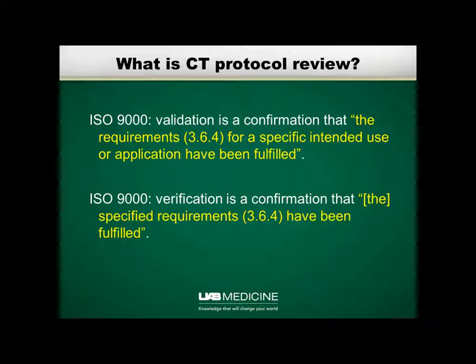Well, in CT protocols, this means, does this protocol give the radiologist the image that they want? Are we using no more than the amount of radiation that's necessary for this? Is the injected contrast media appropriate for this? Giving a patient too much injected contrast is as bad, maybe worse, than giving them too much radiation.